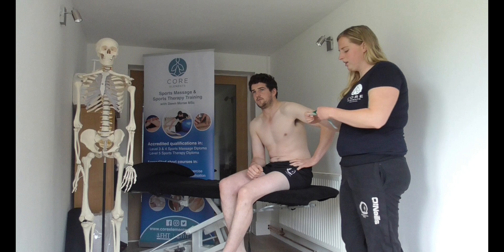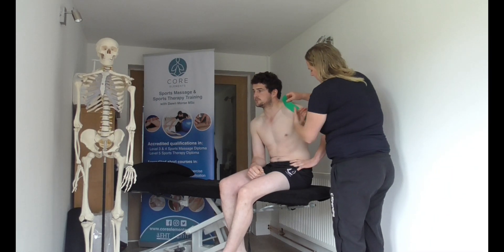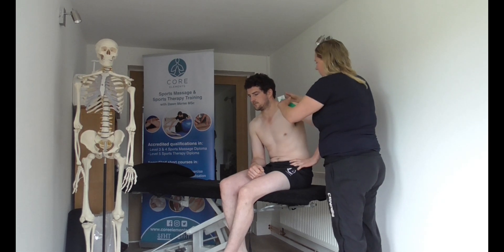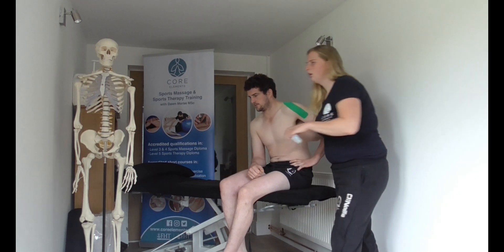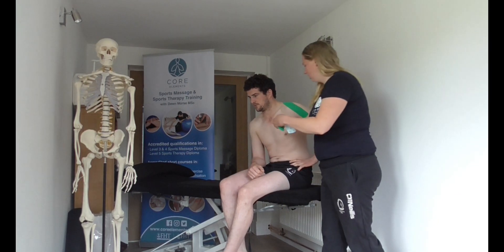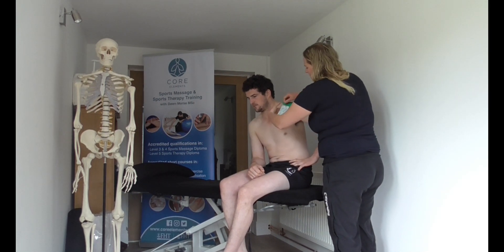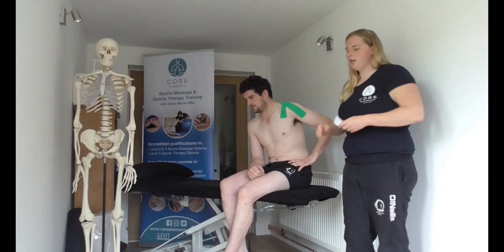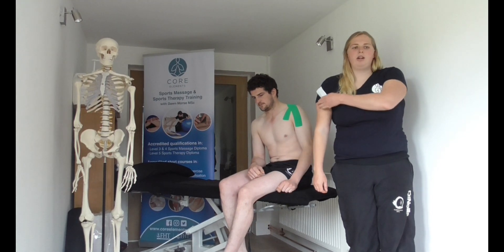The aim of this is to lift the AC joint upwards, so we're going to lift the joint up and back. Same applies — we're going to lift inwards and upwards. As the client relaxes off, they should feel a rise in their AC joint, with the tape providing a lift.